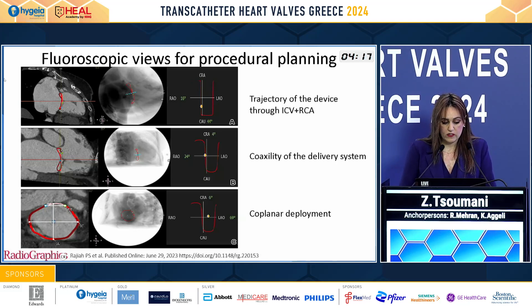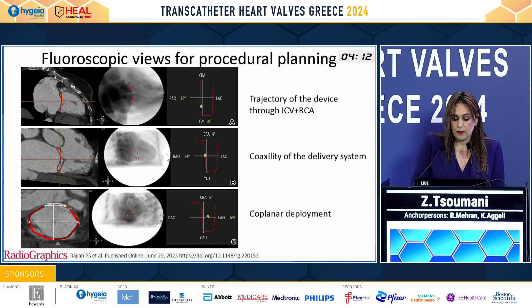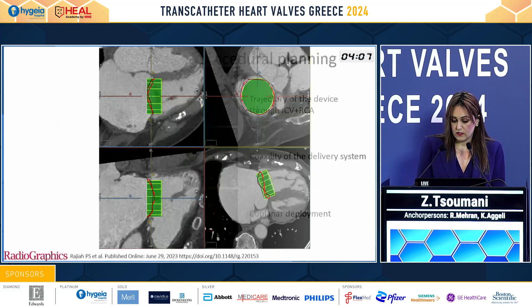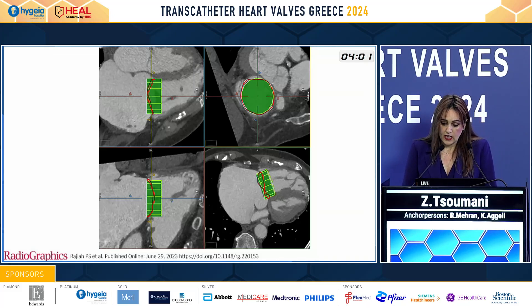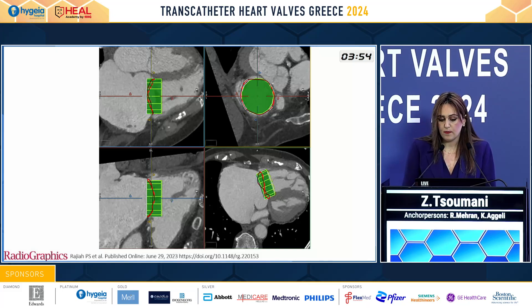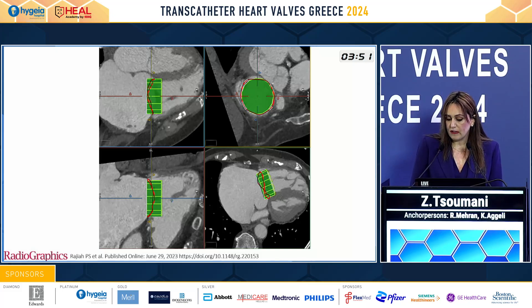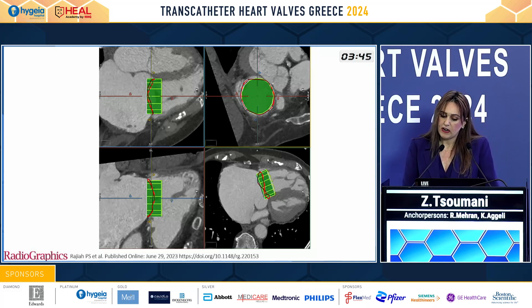The three-chamber view can help with the coaxiality of the delivery system, and the short-axis view can assist with co-planar deployment. Using dedicated software, we can simulate specific valves in order to find the precise size to prevent right ventricular outflow obstruction as well as any paravalvular leak.